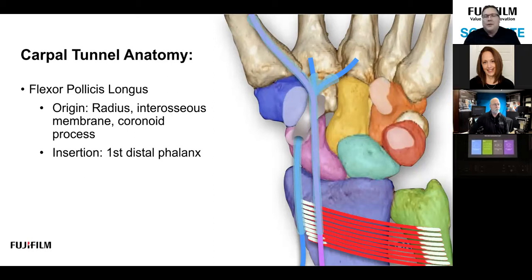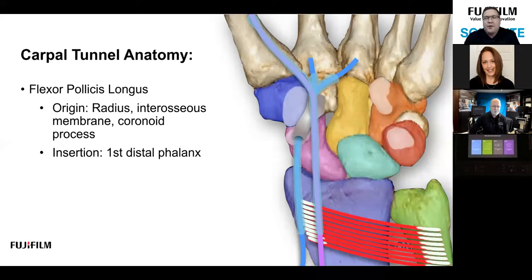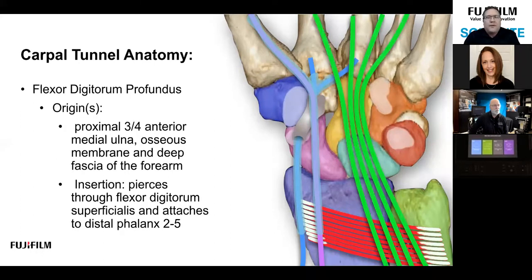Just internally within the carpal tunnel is the flexor pollicis longus (FPL). It is within the carpal tunnel but does have its own tendon sheath, so it is not part of the bursal/tendon sheath complex. It does travel through the contents of the carpal tunnel. To isolate this particular tendon when scanning, just flex the patient's thumb and you'll see it move independently of the rest of the structures.